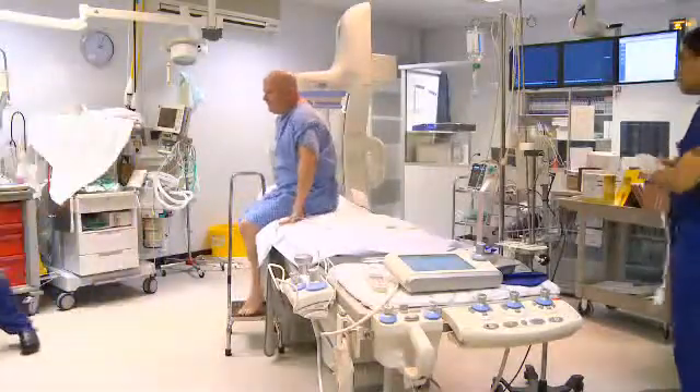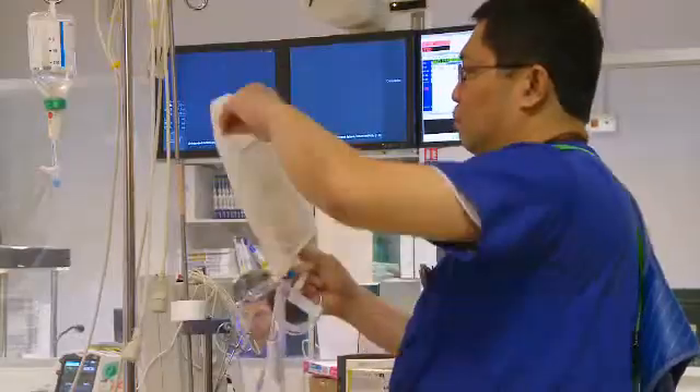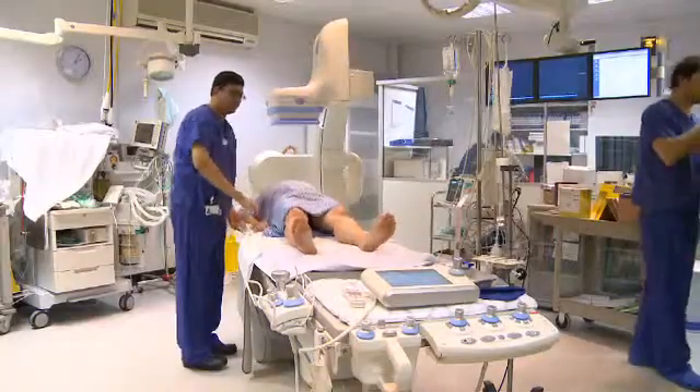Once you're in the cath lab, we will lie you on the catheter lab table and put some local anaesthetic in your groin, and then we'll put a small tube into the artery. You're going to be awake during the procedure and you will feel a bit of pressing and discomfort in the groin initially, but thereafter you shouldn't feel anything.